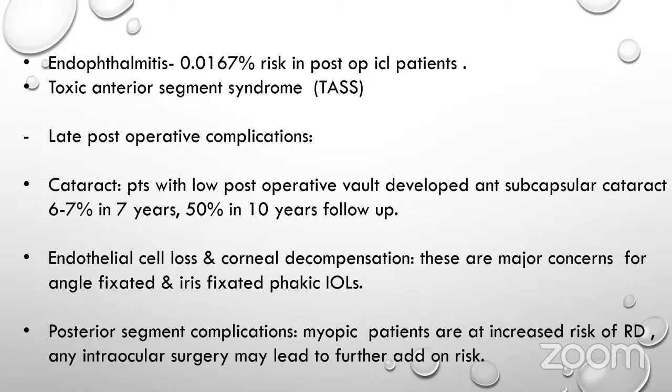Next. Posterior segment complications. Myopic patients are at increased risk of RD. Any intraocular surgery may lead to a further add-on risk.